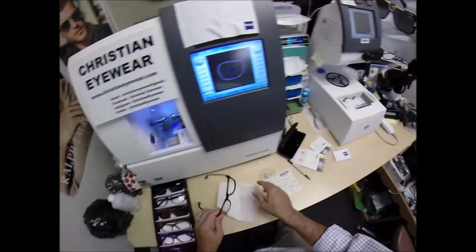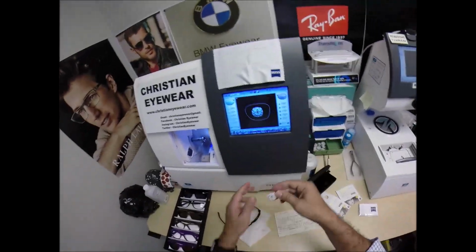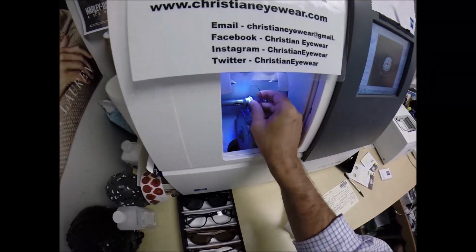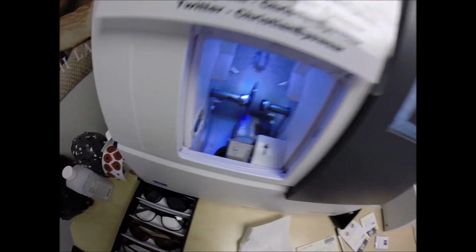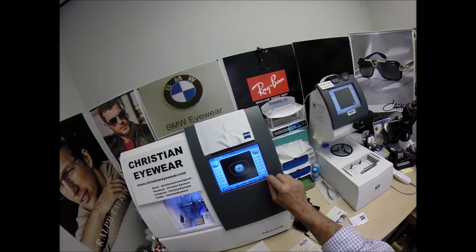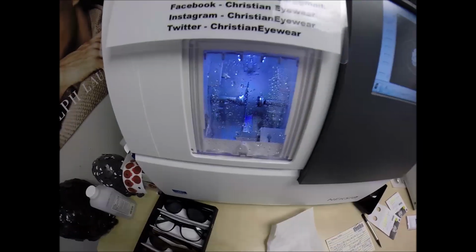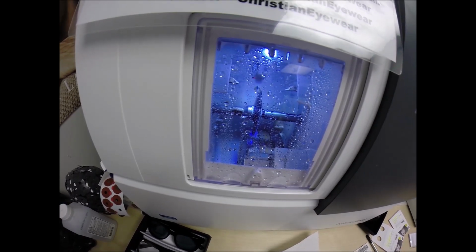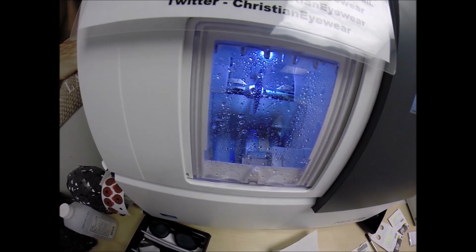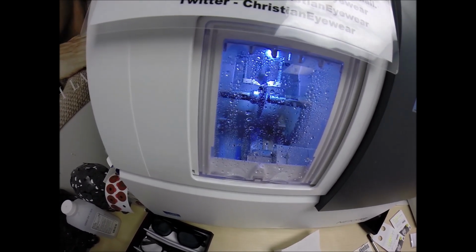Now I can go ahead and start cutting the left lens. Flip that over to L. Place the magnet into the chuck, the Charles, the Chucky baby, the Chuckarama. Hit the green start button. The door closes, the clamp shuts. Just like before, it's going to be traced by 2 white styluses, making sure that it's large enough to fit into the frame on the first go round.